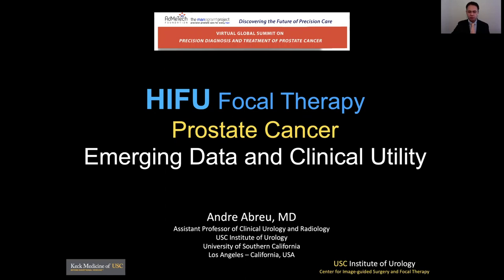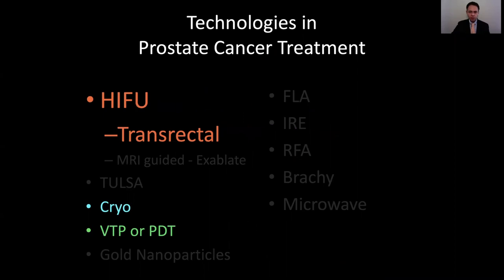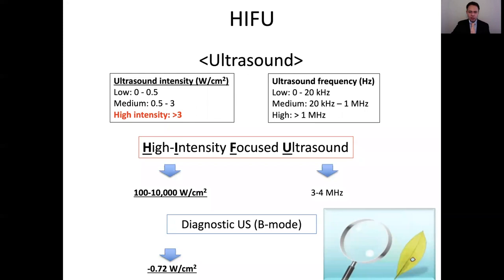Thank you for the opportunity to talk to you about emerging data and clinical utility of HIFU focal therapy in prostate cancer. There are currently several technologies and energy modalities available for prostatic tissue ablation. I will focus on HIFU applied transrectally. HIFU stands for high intensity focused ultrasound. That means it is an ultrasound energy that is delivered to a focal point with high energy or high intensity.